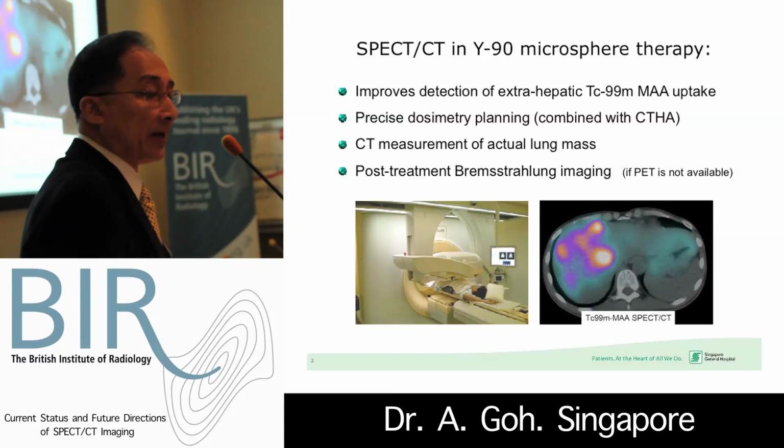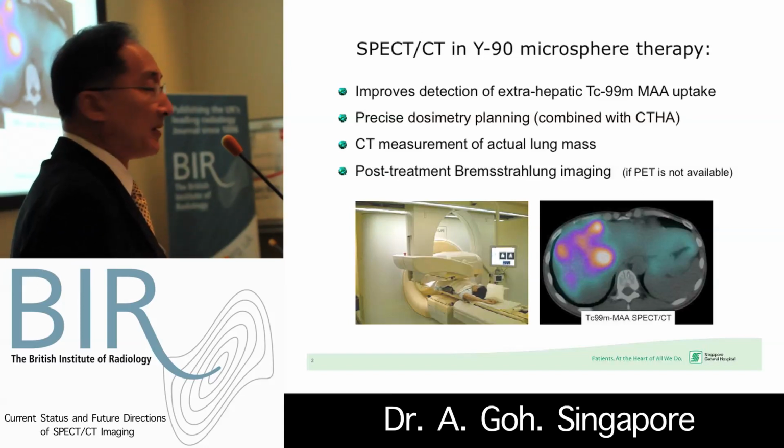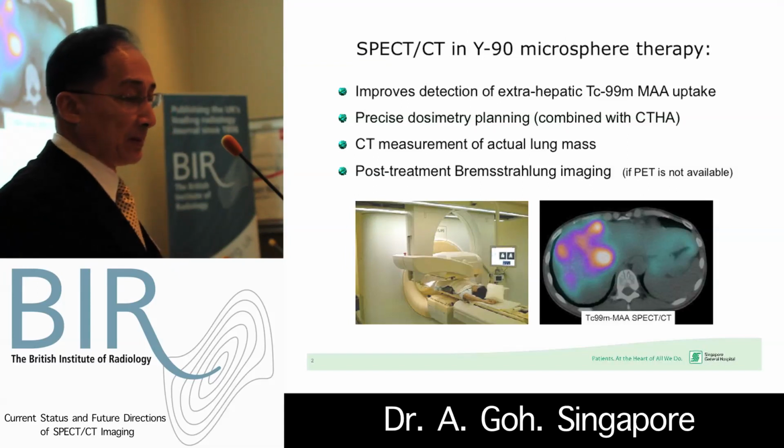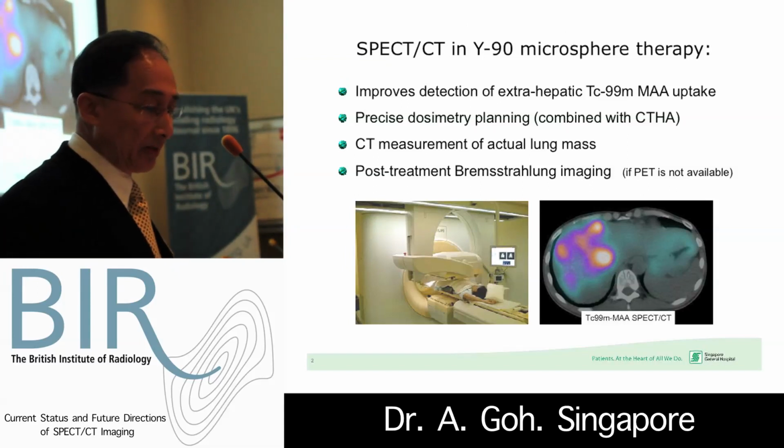Although I have a little caveat, which is that PET is probably superior, so we put it there as an option if PET is not available. Oh yeah, we do have that big monster of a machine in SGH too.